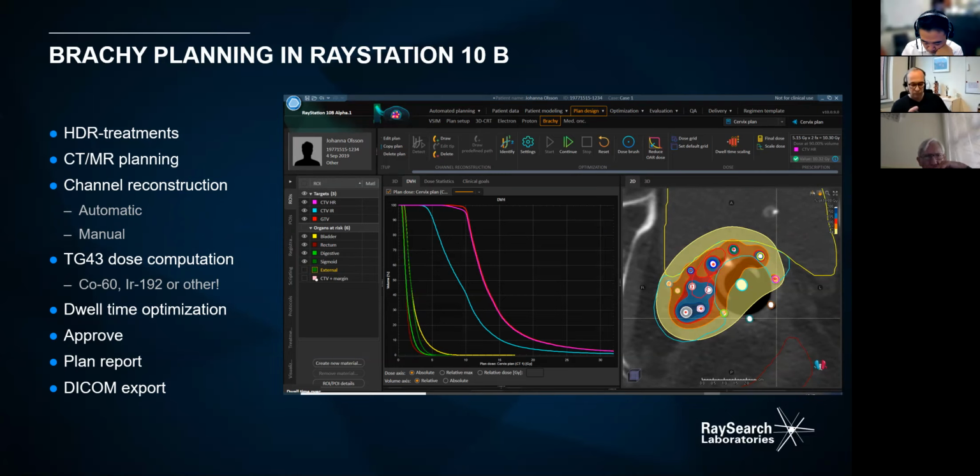This is Zubir. I have a question regarding the previous slide where you stated that you can sum the external beam portion with the brachytherapy. In brachytherapy, the gland may be swollen, whereas during external beam the gland is pretty much smaller. How do you account for that?